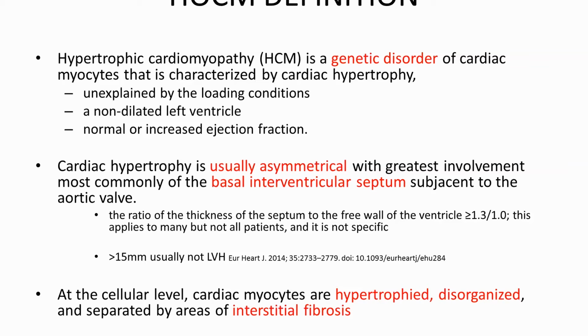And Sam, you may know a little bit more about that, given that you do a lot of routine clinic echo. You probably see a lot more of the routine stuff coming through. But generally, I've always been taught if you're greater than 15, you're going to be thinking HOCM. Yeah, I've seen that before. I've often thought the same thing.